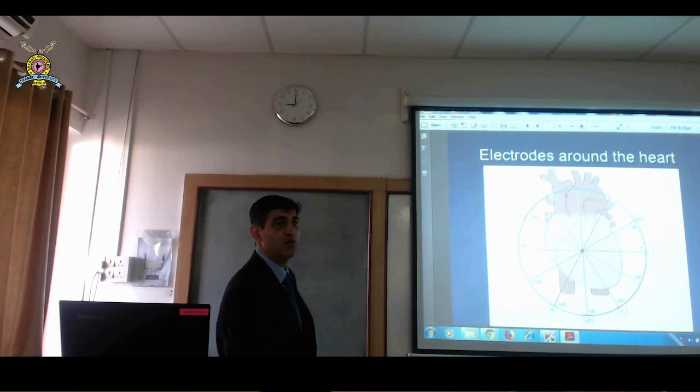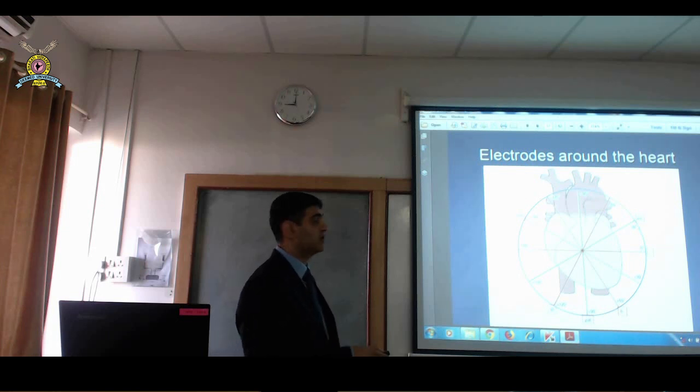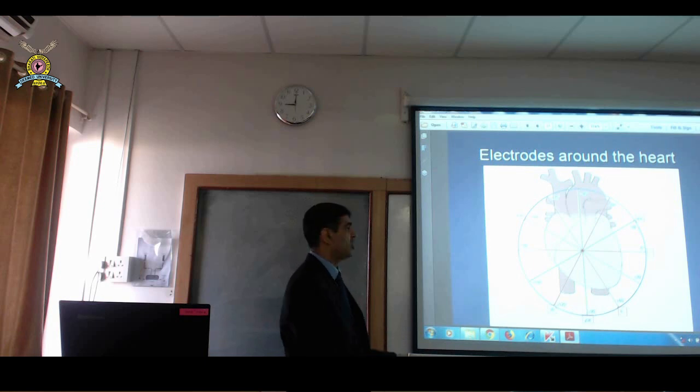So, this is the most important diagram you want to remember. Okay? So, those of you who are very much interested in electricity, another thing I want you to remember is for those who want to understand the axis of the heart. Okay? So 0 degree, this is like a clock. Forget about 1, 2, 3. See, 0 degree, 30 degree, 60 degree, 90 degree, right? 120, 180, 270, and then 360. Okay, so this is just the angles, like a simple circle.